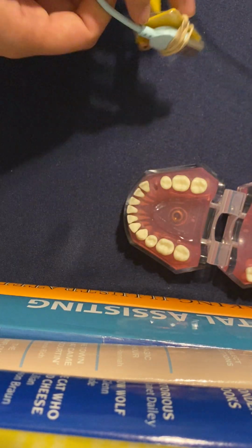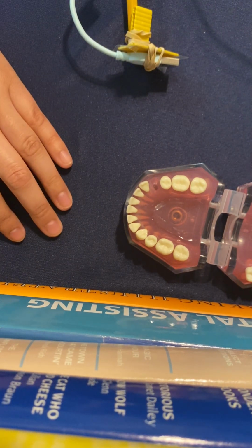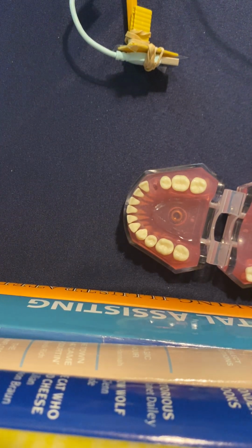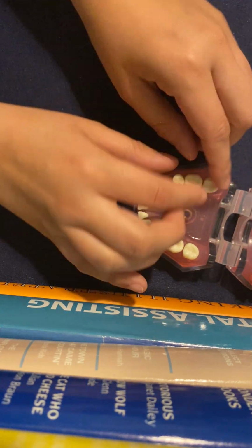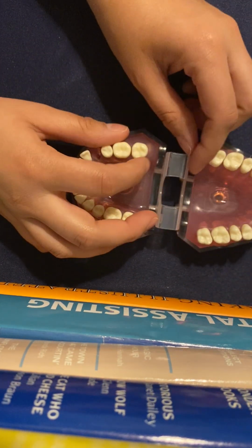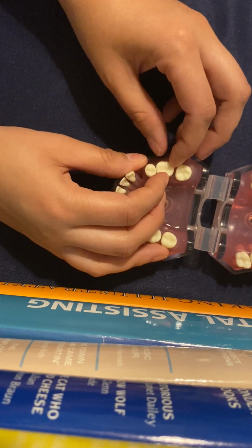After number 7, we're gonna do number 8, which is the maxillary right molar. So we're just gonna scoot it a little back more. You're going to want to center it on the second molar, which would be this one. Normally there'll be a third one, but this typodont must have had dental work done.